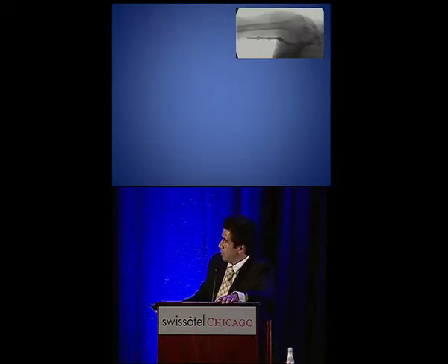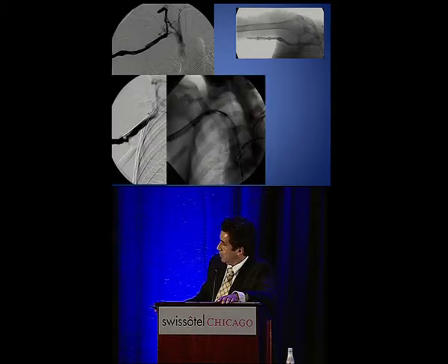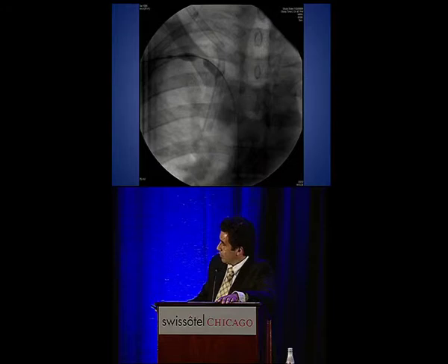And these are some examples. Patient comes, you do the venogram, cross the lesion, do the lysis, and then after the decompression, the patient has symptoms again, then you go back to the angio suite, shoot another x-ray, you see that there is still some anomalies in the vein. Well, you use a balloon, and you can see the give on the balloon, and usually you get excellent results. But not without problems, and we learned this the hard way.